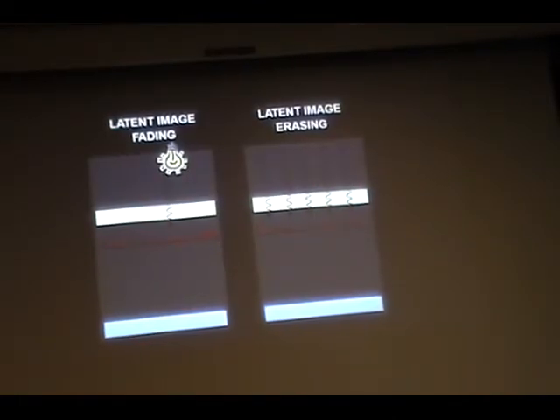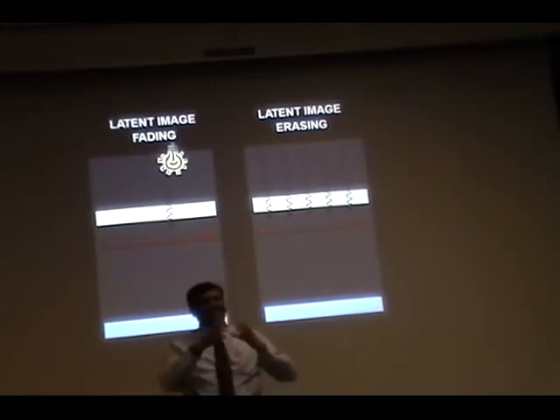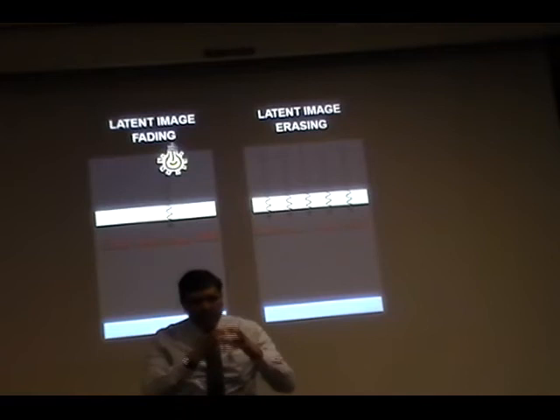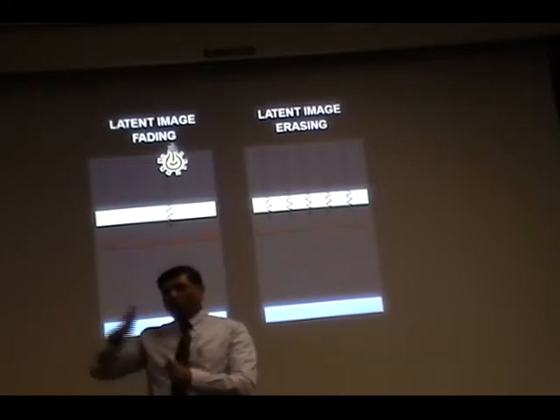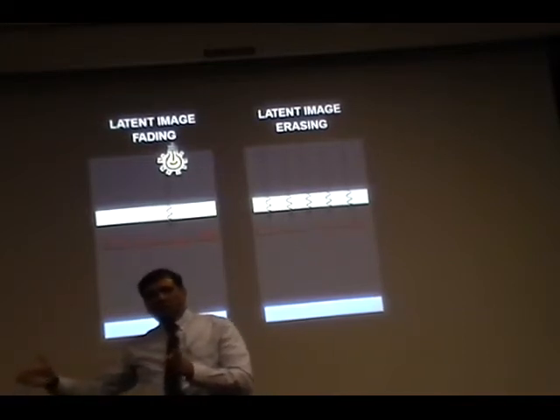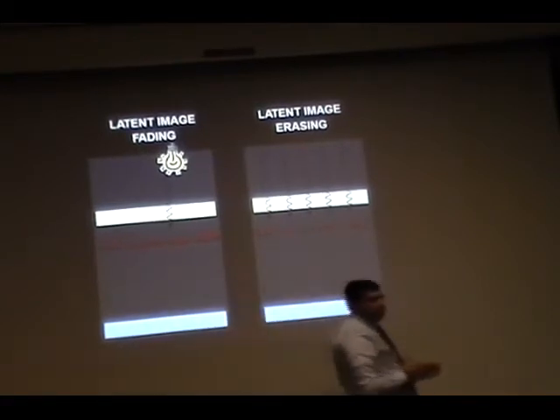So please make sure that with some of the older machines, when you put it in the scanner, there is a latent image, an image that is still present. So you have to expose it to light to clear the image before you take one more image. Make sense?